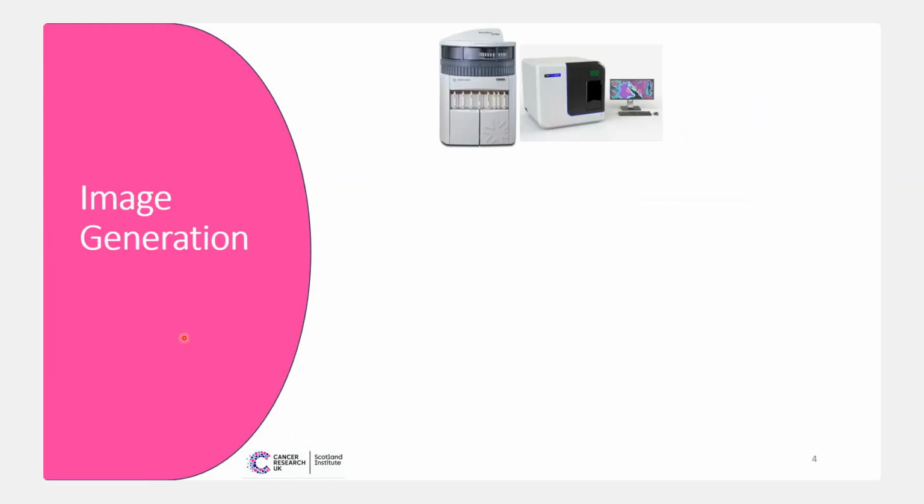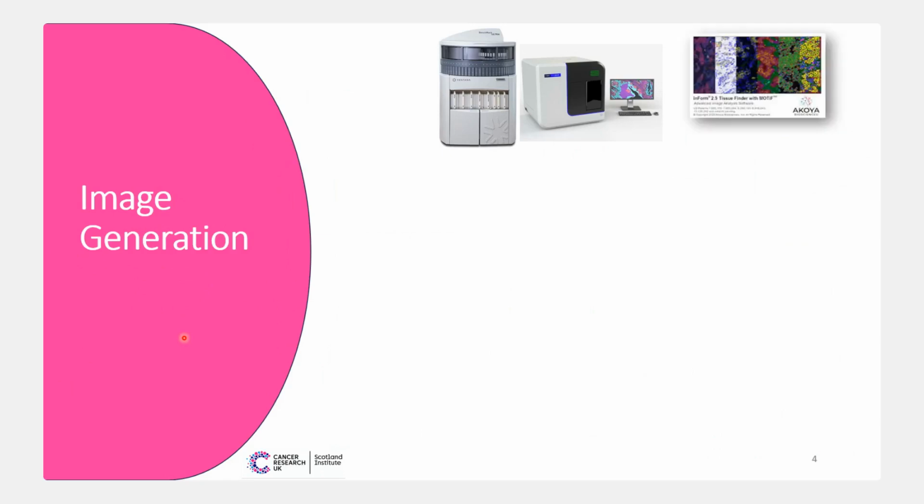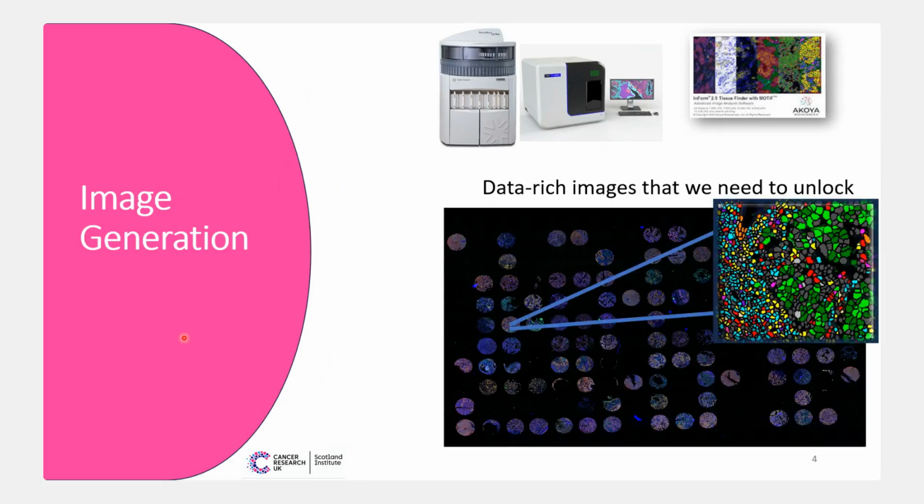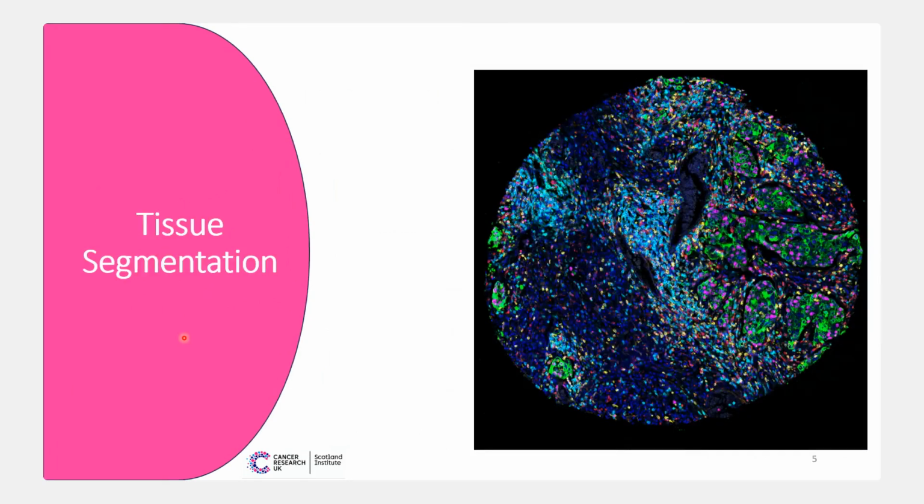So even with our lower plex assays, or the images that we generate from the Ventana and the Akoya PhenoImager, we then spectrally unmix them using the Akoya inForm with project-specific spectral libraries. And even though they are our lower plex, we generate highly data-rich images, and I'll talk you through how we analyse most of our images as we go.